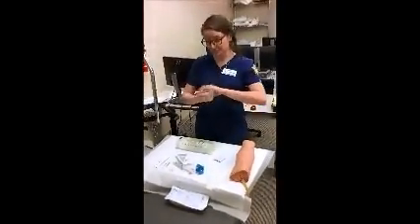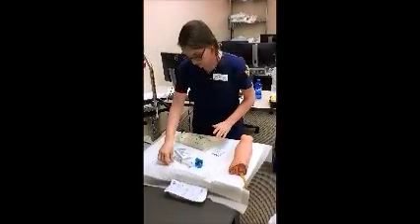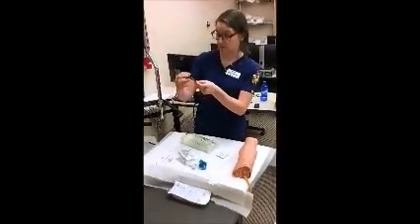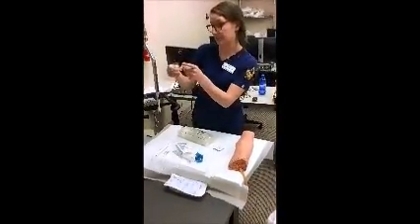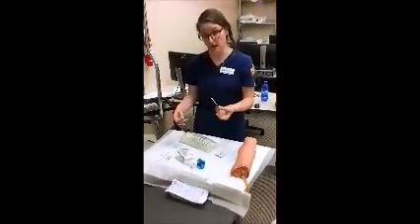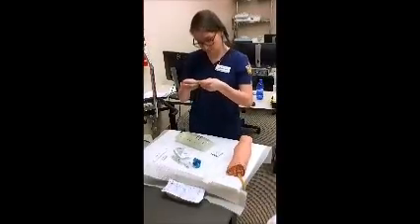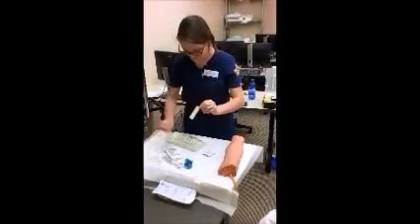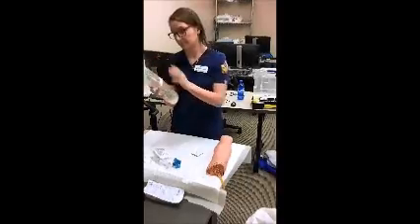So we're going to perform hand hygiene. Now we will label our bag with the patient's name and the start date, then the discard date, the time of infusion, which would start at 1:30, 13:30, and the ending of the infusion, which would be at 21:30 or 9:30, giving us an 8-hour infusion. Also has the RN's initials on the bottom. So we'll go ahead and label our bag. We're going to want to label that on the back side as to not interfere with anything.